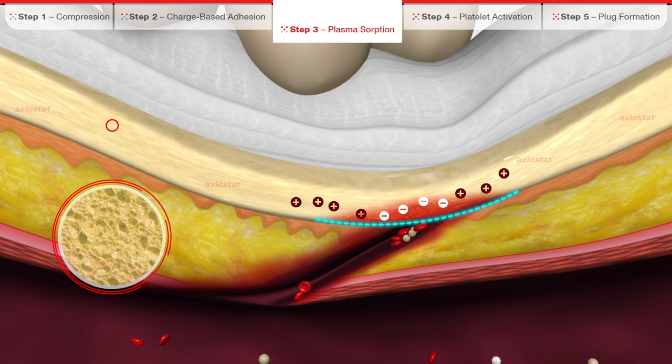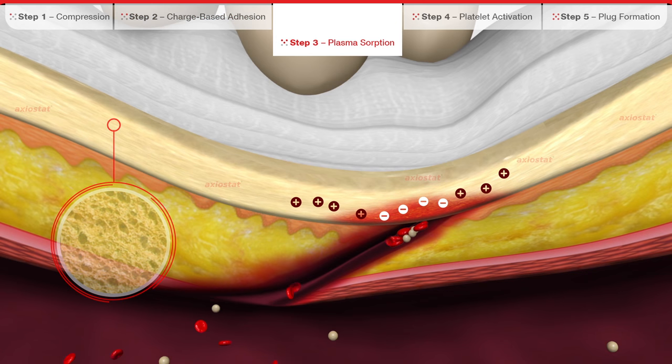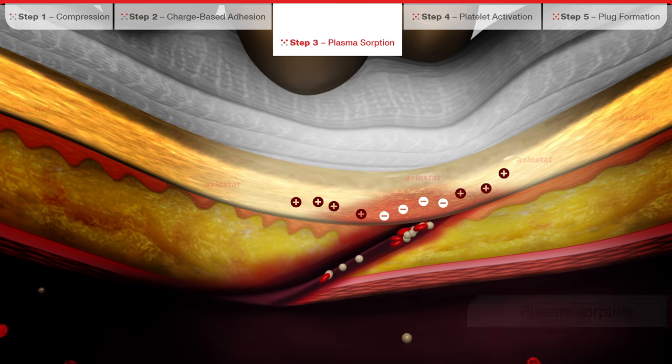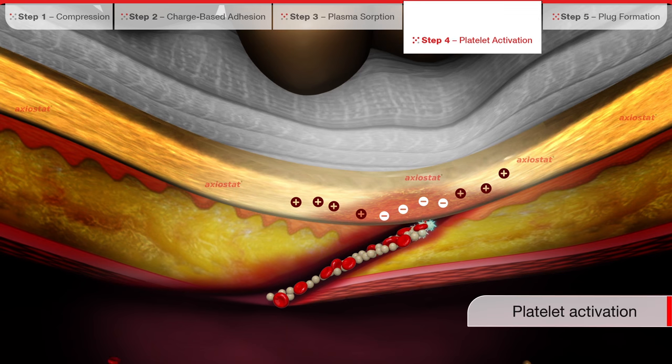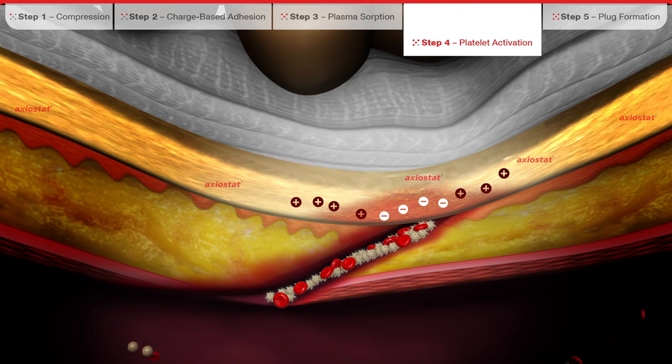The porous structure of Exeostat enables the rapid absorption of plasma from the blood. This leads to the rapid concentration of erythrocytes and platelets, resulting in the agglutination of these blood elements. Exeostat now activates the platelets, triggering the intrinsic coagulation pathway for the blood.